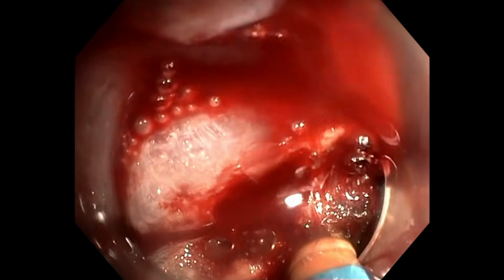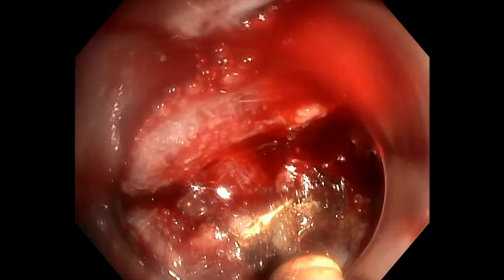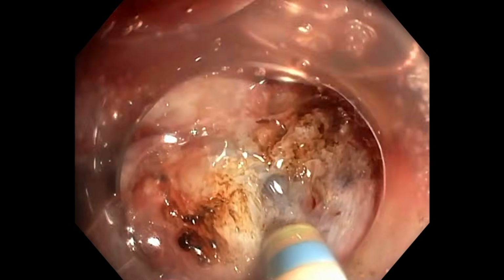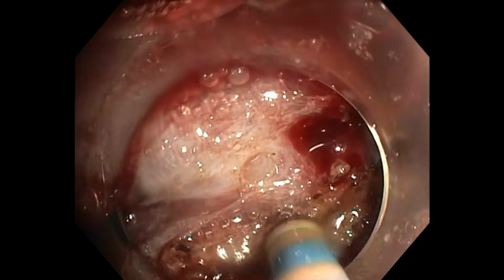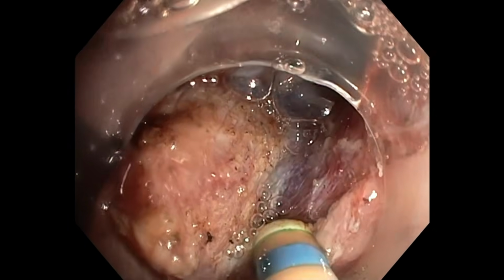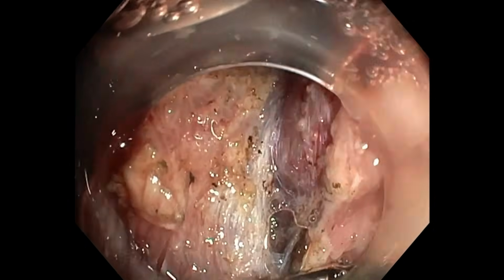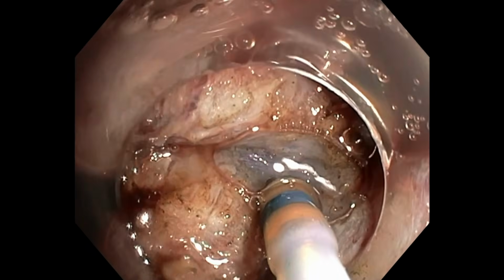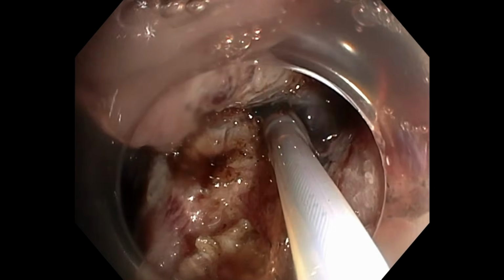Usually there is a big vessel in this part because the muscle retracting sign is created by a large vessel that is feeding the very large protruding lesion, and therefore it is very important to go slowly but from blue to blue.